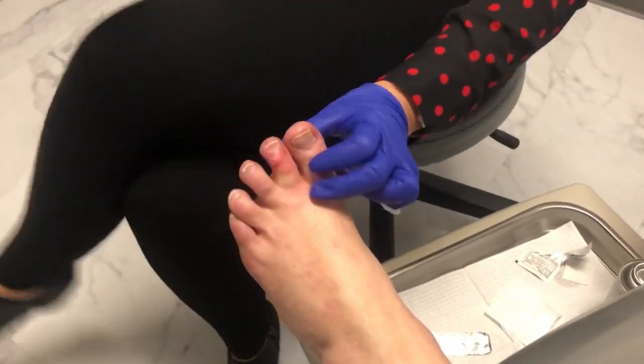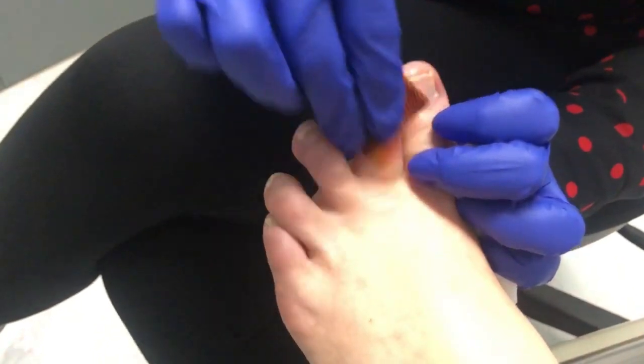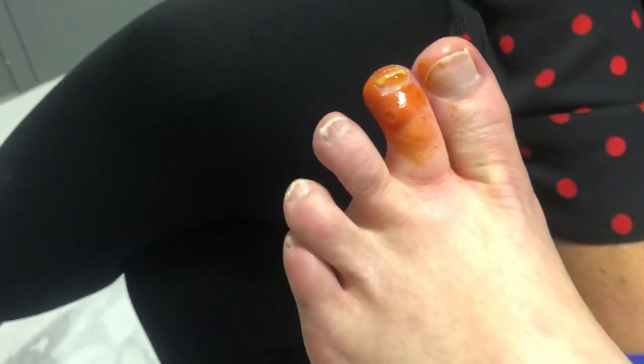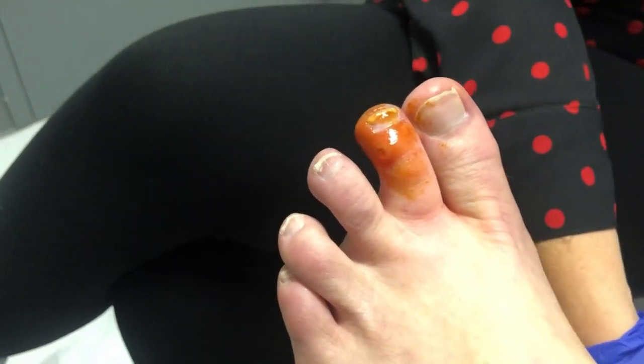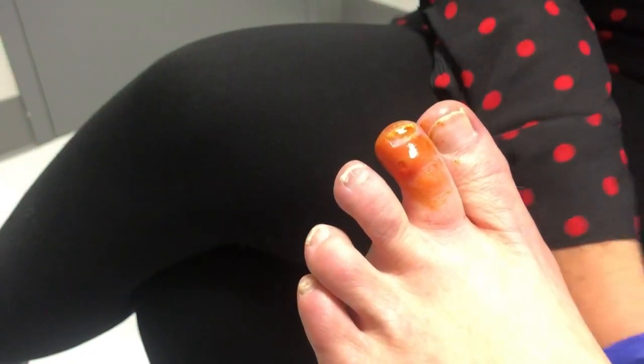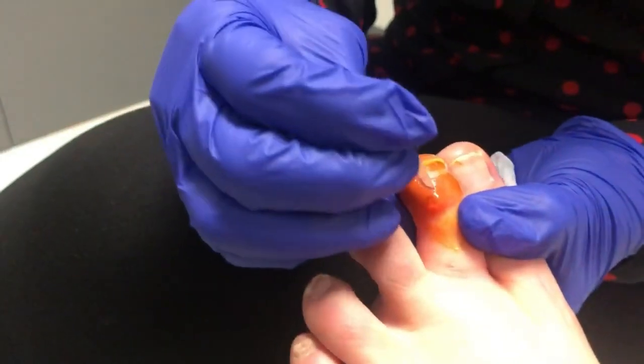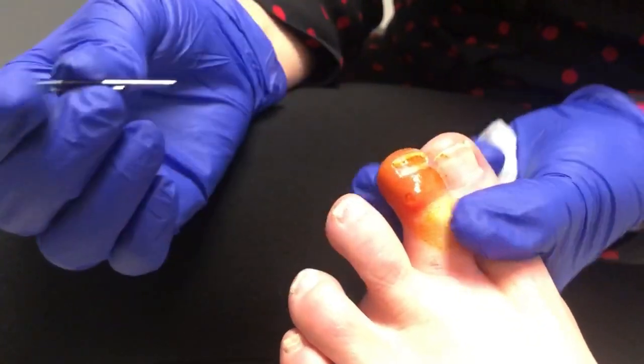There's a little cyst here. I don't know what it's filled with — it could be gelatinous jelly from a ganglion, or it could be serous fluid. She did hit her toe yesterday. I did x-rays and it doesn't appear to be broken, so we're going to scratch the tip of it and see what comes out. Can you feel this? No.